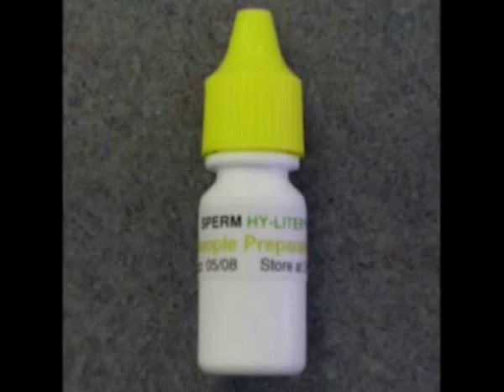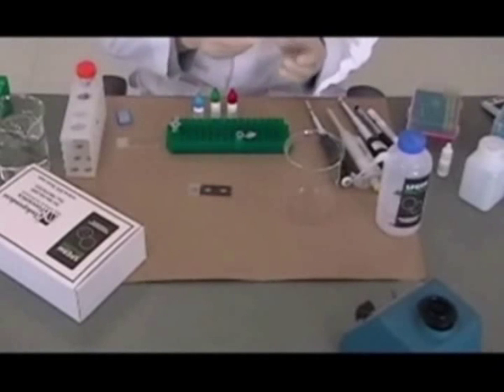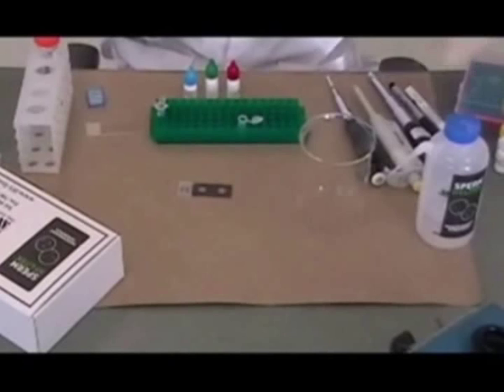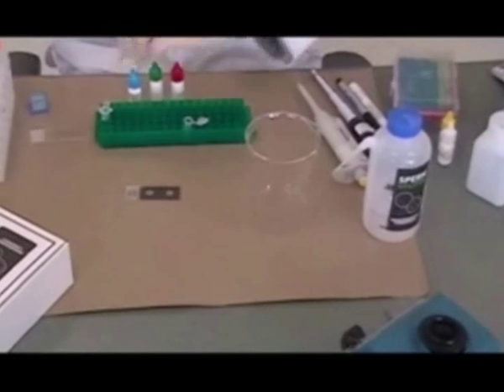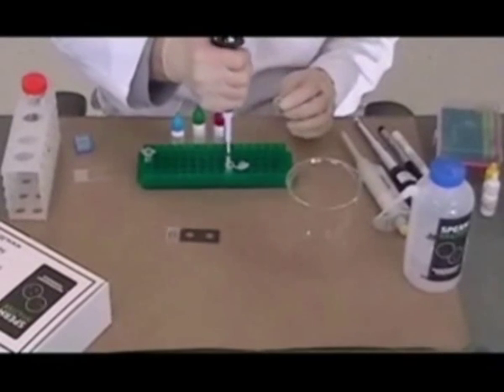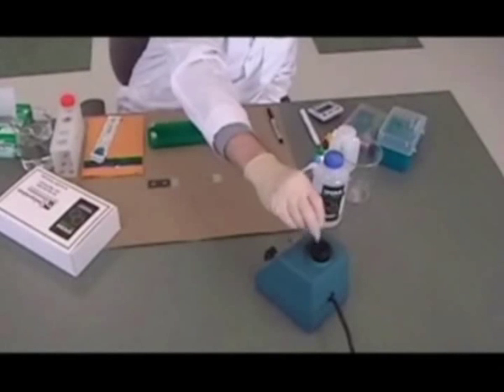Sample preparation solution plus DTT must be freshly prepared. For each sample to be stained, two drops of sample preparation solution from the yellow capped bottle are combined with one microliter of freshly thawed 1 molar DTT. The solution is mixed thoroughly and is immediately ready for use.